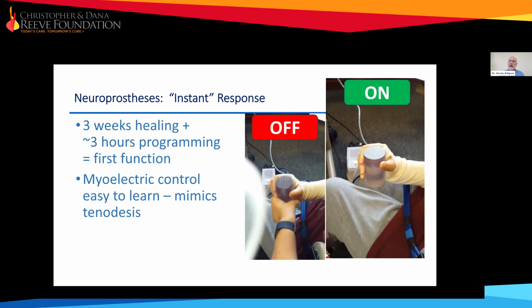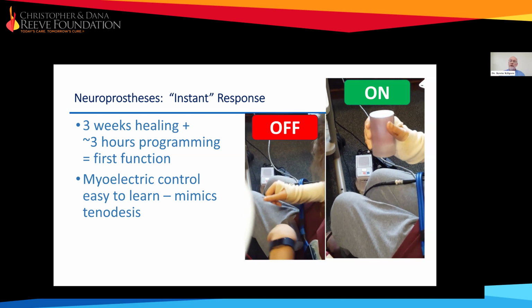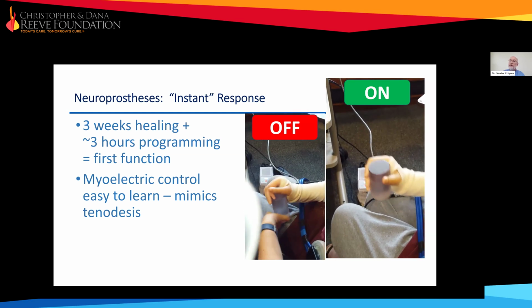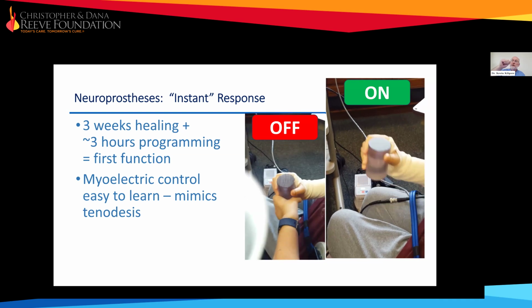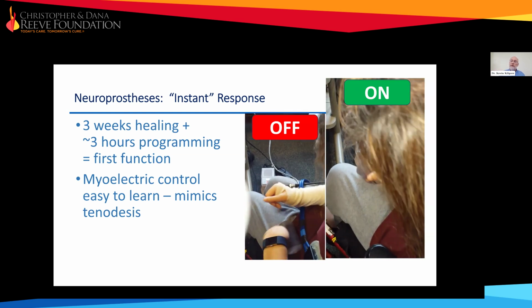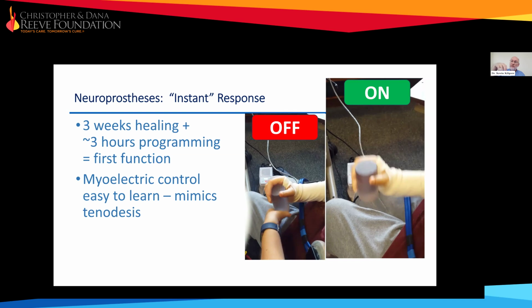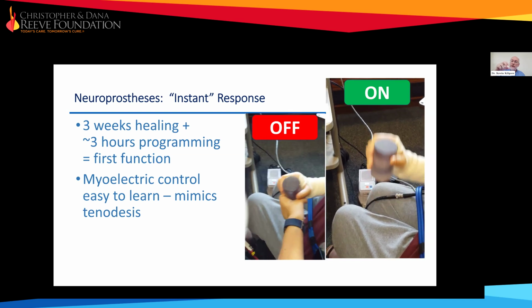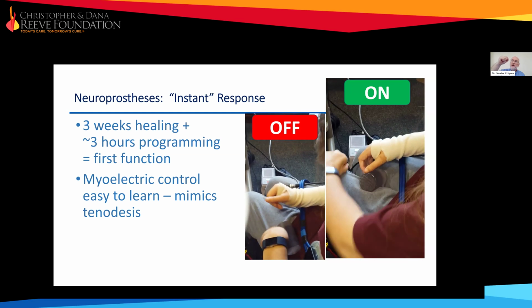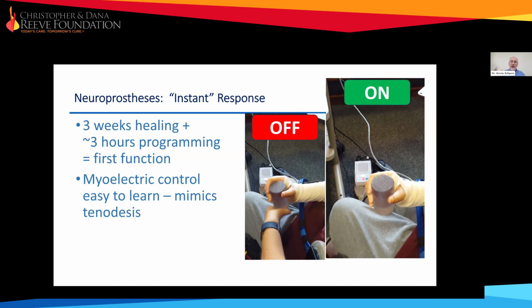So if someone is listening and they have a cervical level spinal cord injury, and if you have wrist extension, you've already learned that if you pull your wrist up, you can pick up light objects like a potato chip or maybe a piece of paper. Just because when you pull your wrist up, your hand naturally closes. It's not very strong, but it's pretty useful. And what we're able to do with the electrical stimulation is convert that tenodesis from a weak, very passive motion to something that has the force of the muscles behind it. So it becomes very strong, but it's still the same motion. You drop your wrist, your hand opens a little bit, you pull your wrist back up and your hand closes. So I hope that helps.